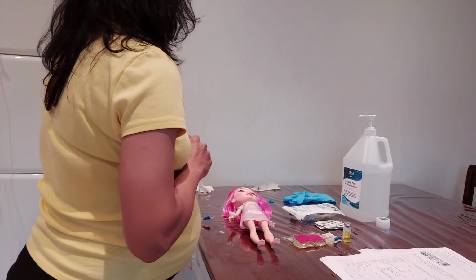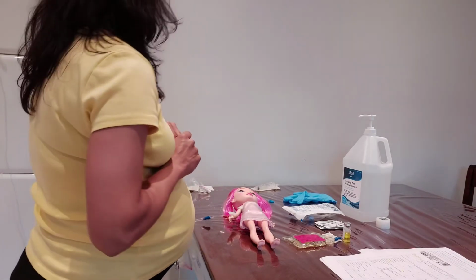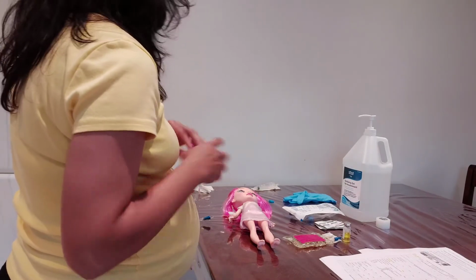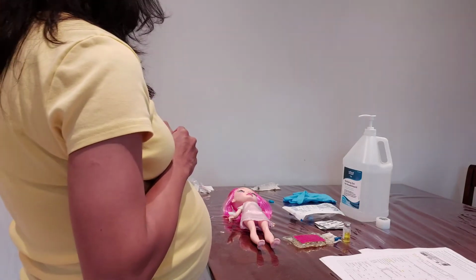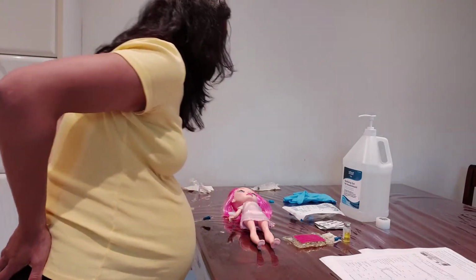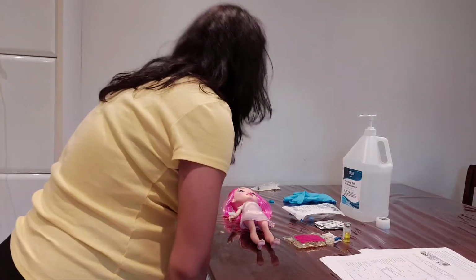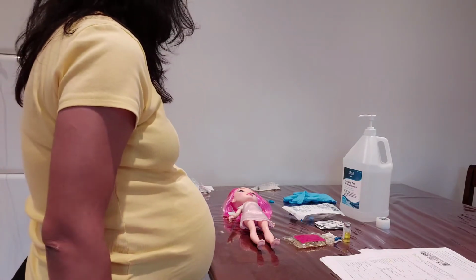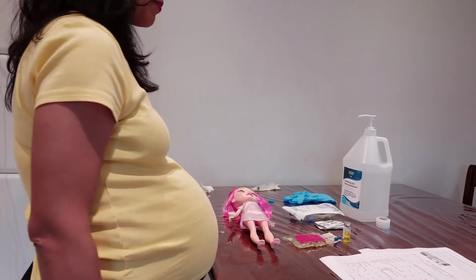Miss PNL, how are you today? Good. My name is Fatima. I'm your nurse. I'm going to be administering IV medication by piggyback for you today. I need to ask your full name and your date of birth. Thank you. Can I see your wristband, please? Perfect. Do you have any kind of allergy? Any medication allergy? No? Perfect. Thank you.